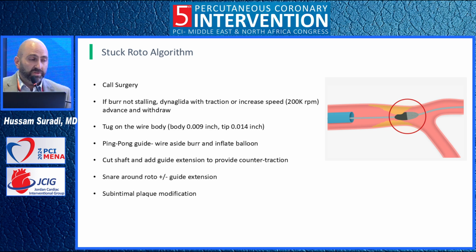And if you remember from this discussion, the surgeons were very upset. They said, if anything happens, do not call us. We're not going to support you in this case. If the burr is still rotating but it's stuck, you can try putting the burr on Dynaglide or going to higher speed and try to advance and withdraw and be lucky to free it.